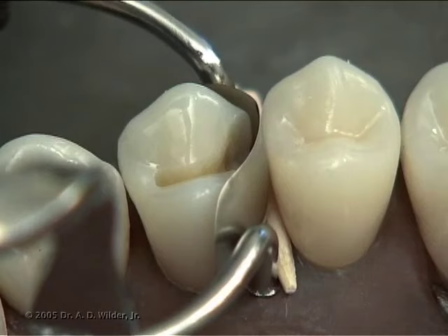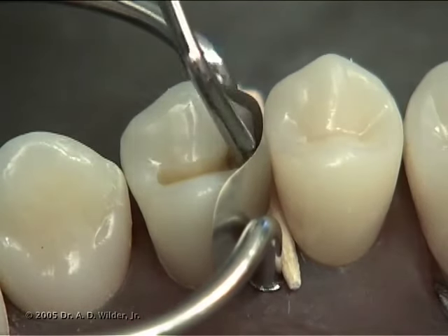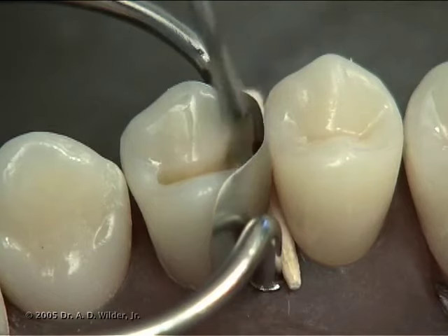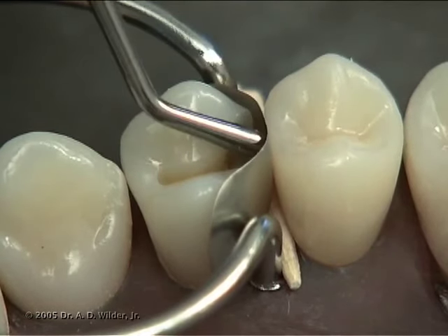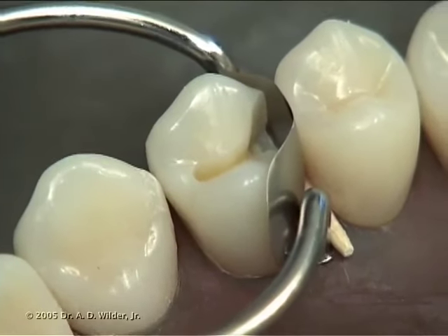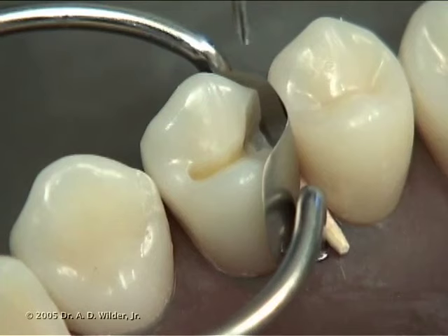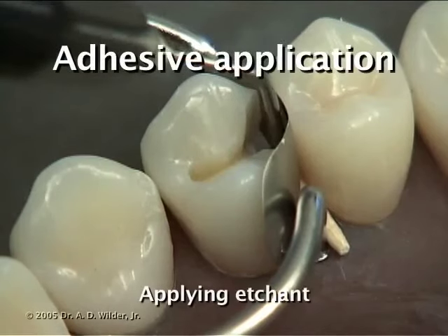Then deliver the sectional matrix ring with its ends between the band and the wedge, or straddling the wedge on either side, depending on the system you're using. With a round or flat instrument, burnish the matrix band against the adjacent tooth to ensure a good proximal contact. Once your assembly is set, we can move to the next step.